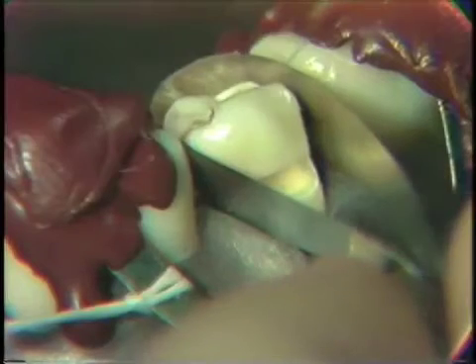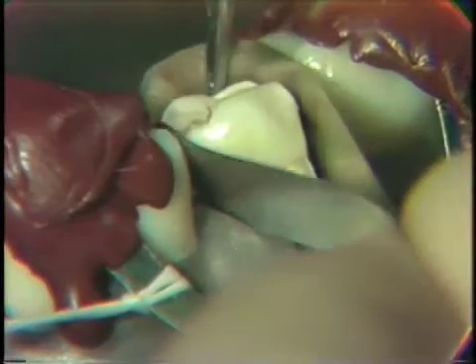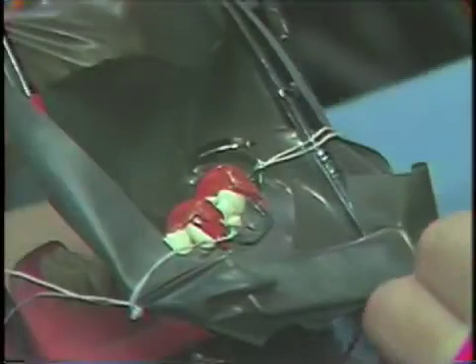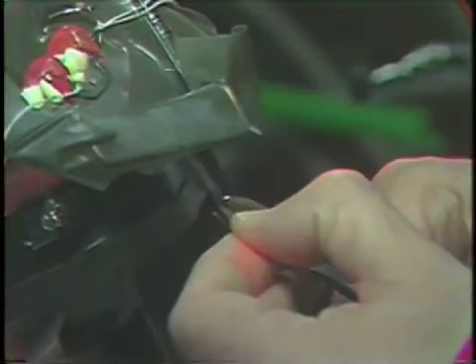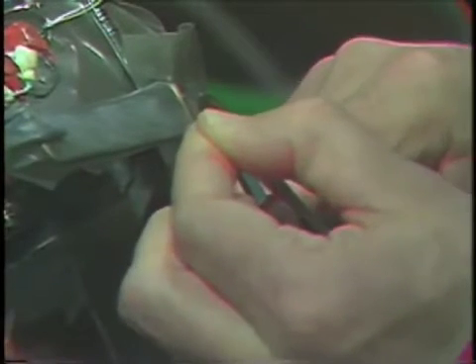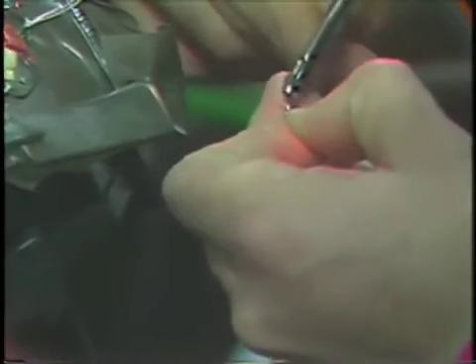With it scored in that position, we will now remove the piece of matrix material. Take a crown and collar shears and appropriately contour the ends of this matrix. Note that they are rounded so that there are no sharp edges that might injure your hands while you're working.